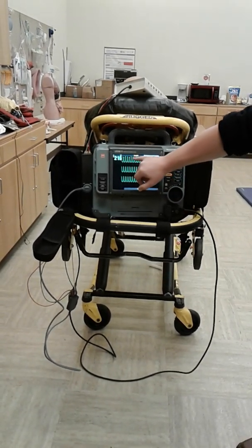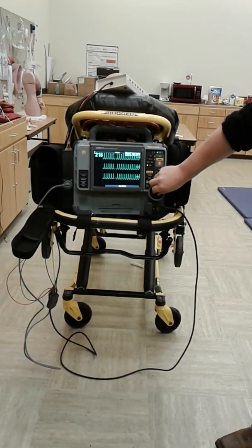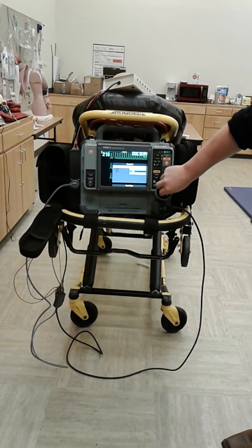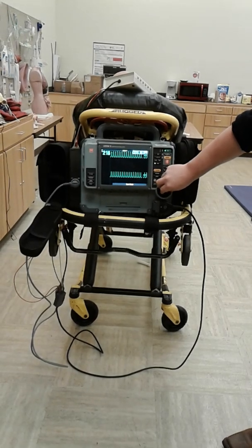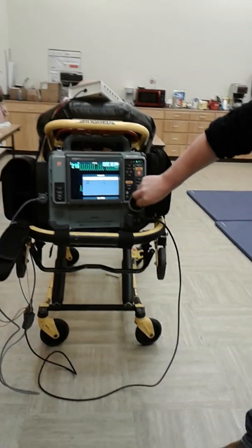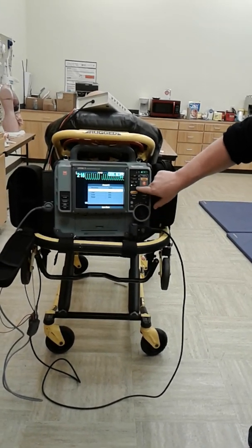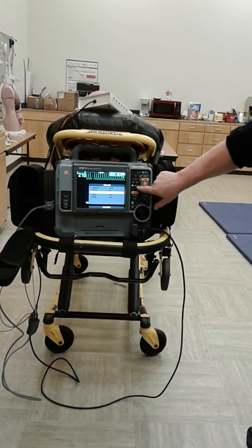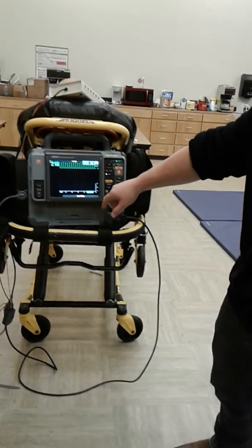Notice up here at the top. Come through. Let me see if I can change this to Cascade. See if they show it down here too. Yeah. That's what we got. Okay. Don't worry about that right now.